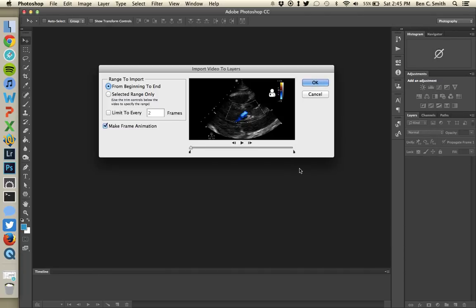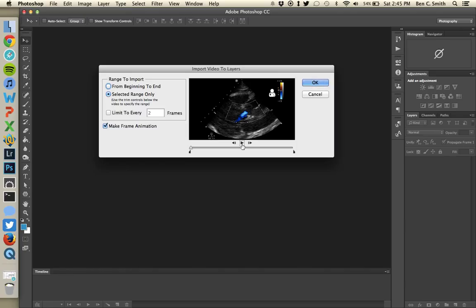This is a patient who has aortic dissection with aortic regurgitation that's brand new. In the dialog box that comes up, make sure you have selected the second option, Selected Range Only — you're going to pull out just part of the ultrasound clip. If you pull the whole six-second clip in, it's going to make an eight megabyte file, which is too large to post on the internet and way bigger than what Twitter allows. Also make sure that 'Limit to Every 2 Frames' is unchecked and 'Make Frame Animation' is checked.